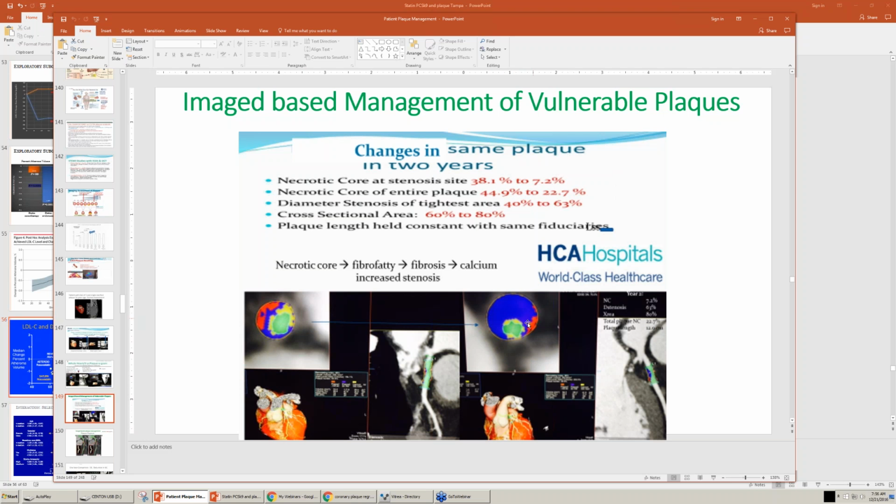And so that's a good thing. And when we look at this, I was visiting with the patient's doctor and the patient, and we were showing him the changes. And I said, I would think at maximal exercise on the treadmill, you would be having some chest discomfort. And he said, yes. How'd you know that? And the patient's doctor said to the patient, you're having angina? I didn't know that. And so here we are reading the plaque, and we're telling the patient and the doctor clinically what's going on.